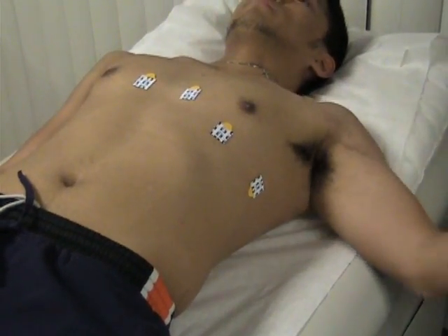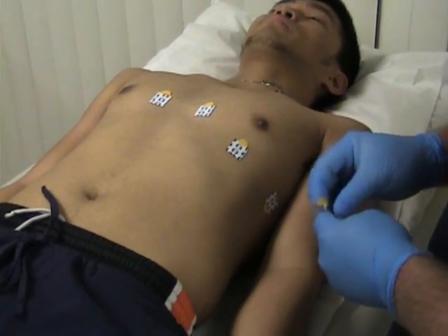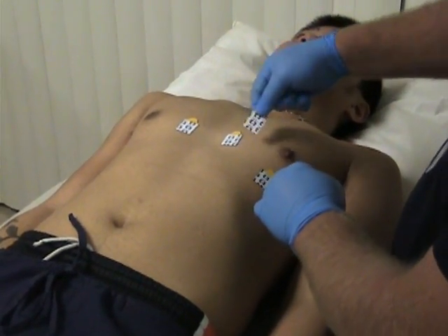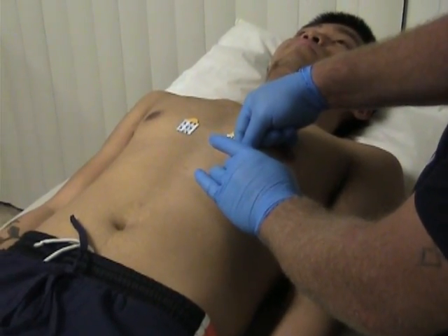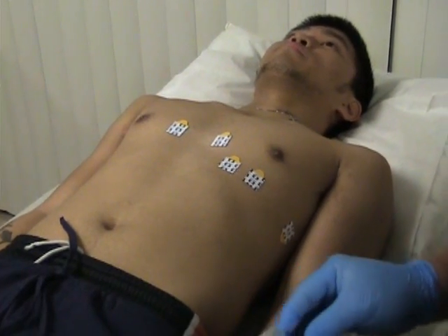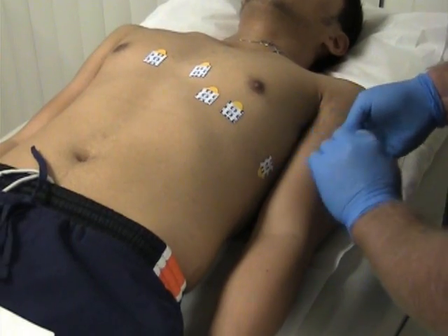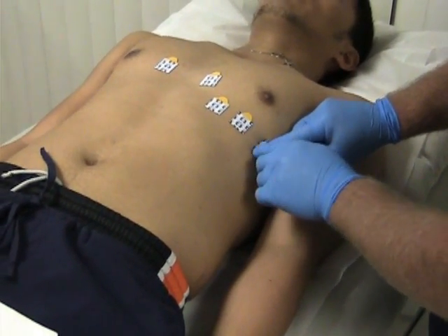Now we bring the arm down. For V3 and V5, we simply place V3 in the center between V2 and V4, on the fifth intercostal space. V5 is placed between V4 and V6, also on the fifth intercostal space.